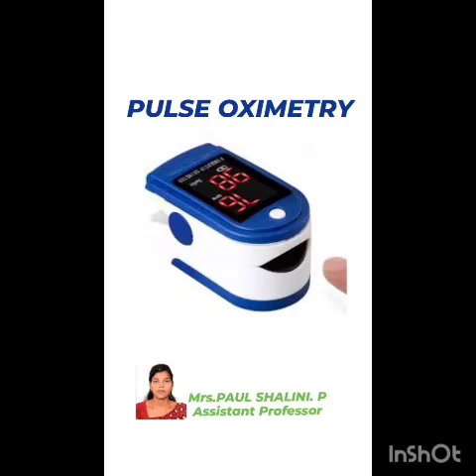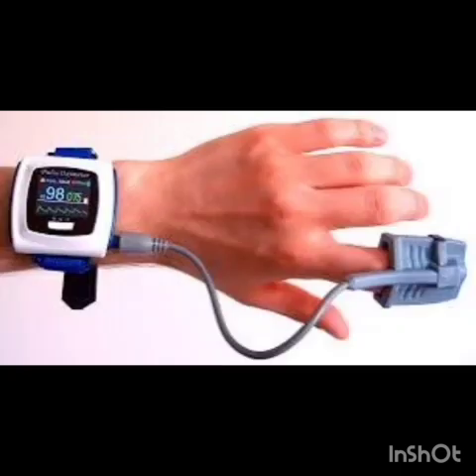Welcome to all. Today we will talk about the topic pulse oximetry. Pulse oximetry is a medical device. It is a non-invasive means of measuring oxygen saturation of the arterial blood.